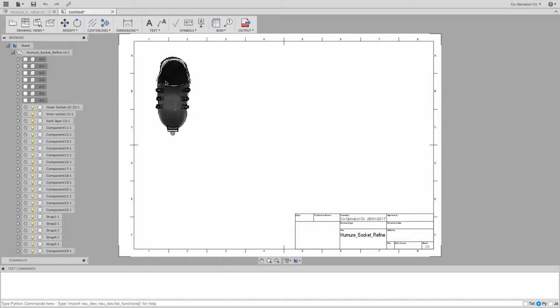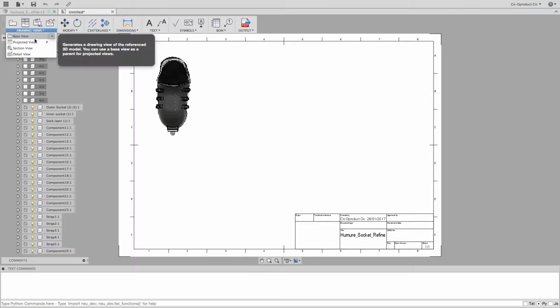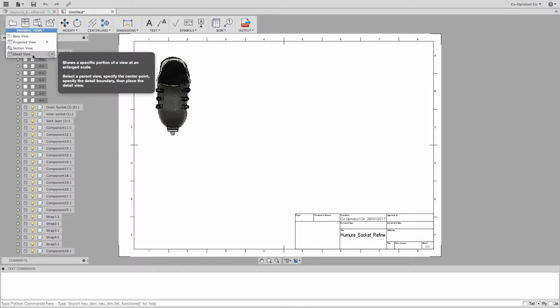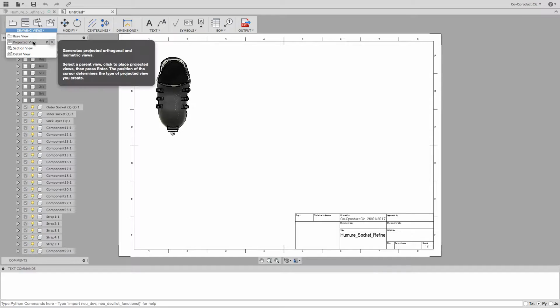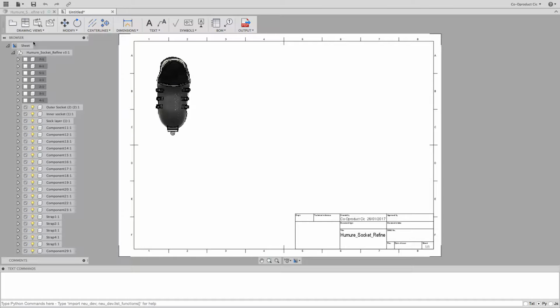In the toolbar, I can create a number of different drawing views, projected views, section views, or detailed views. I've also got tools to modify the drawings, such as move, rotate, and delete. Let's place some projected views. In the toolbar, click Drawing Views, Projected View. Click the base view, then drag out the projected views in the different directions that you need them.